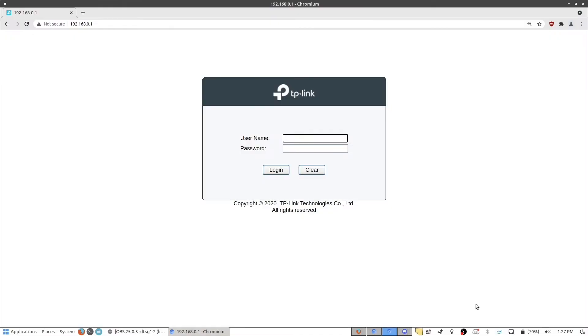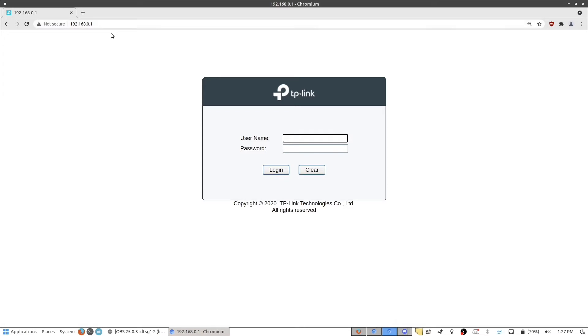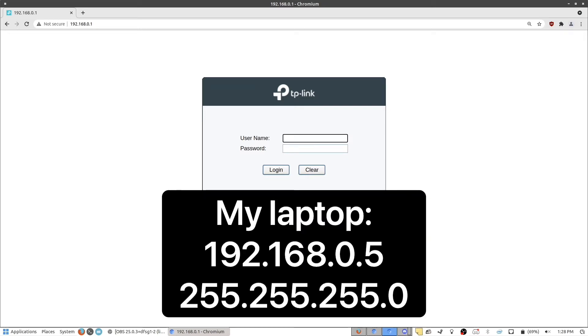So the first thing you'll need to do is configure your computer manually to use an IP address in the range of 192.168.0.1, which is the default IP address of the switch. And I've made videos on how to do this in the past. On Linux, it's a little bit more complicated with my particular setup. But in this case, my computer's IP address is 192.168.0.5, with a net mask of 255.255.255.0.